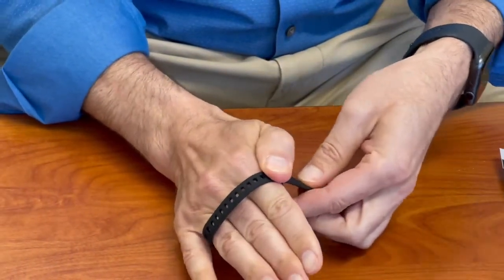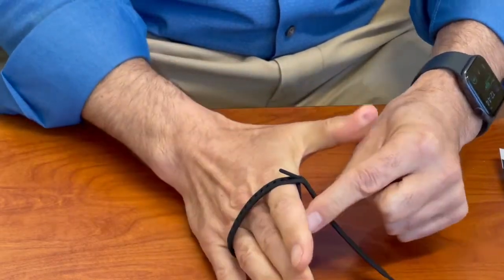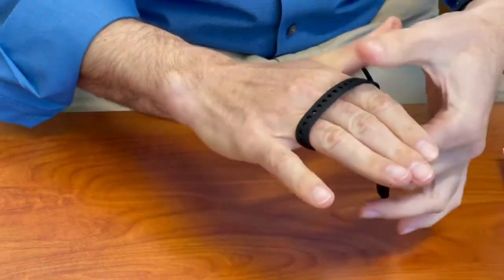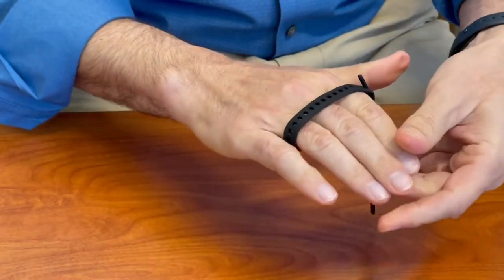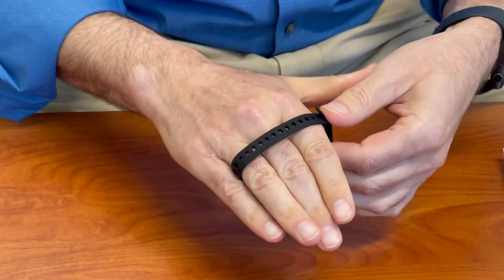And then to test and make sure that this sizing is correct, you can slightly bend the tab and just have the patient go through some range of motion and make sure you're not too tight, not too loose, you allow a little bit of play there.